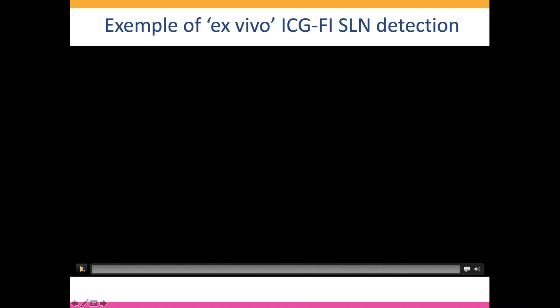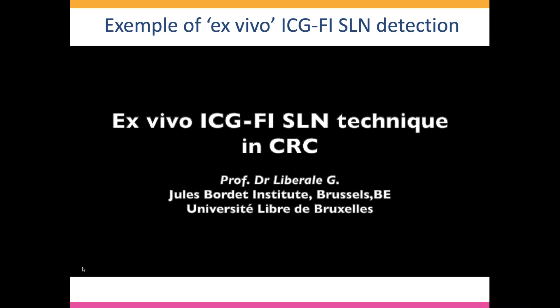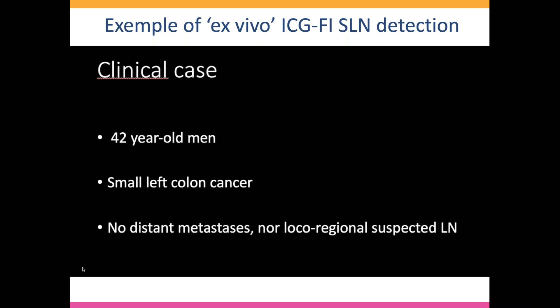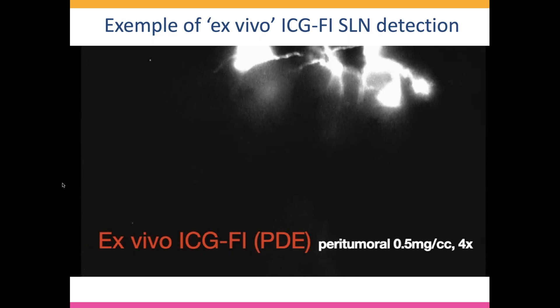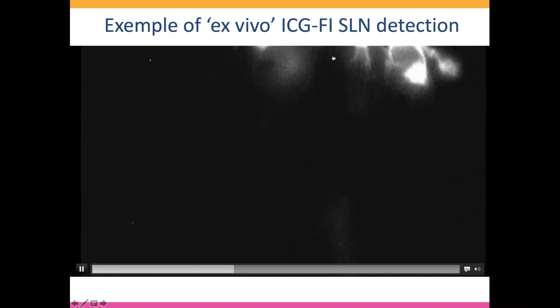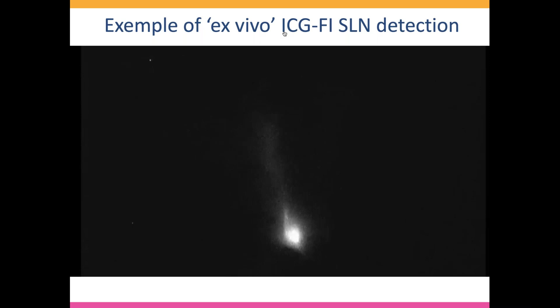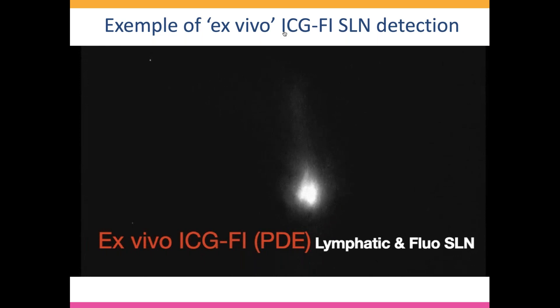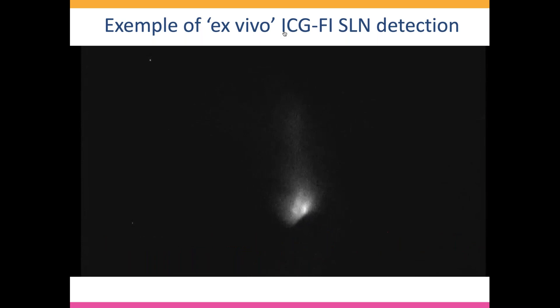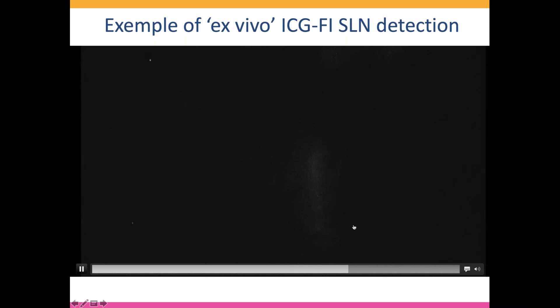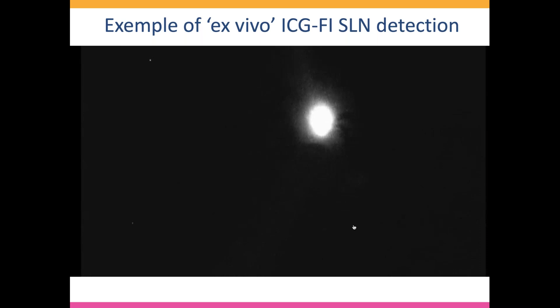Here is an example of the technique: an ex vivo ICG fluorescence imaging sentinel lymph node technique using peritumoral injection. This is the case of a young man with a small left colon cancer, no distant metastasis, no locally suspect lymph node. We see here the different hotspots around the tumor from the peritumoral injection. After waiting several minutes and palpating the tumor to activate mobilization of ICG in the lymphatics, we see the big hotspot corresponding to the fluorescent sentinel lymph node, which is then marked with a blue stitch for detailed pathology analysis using serial section.